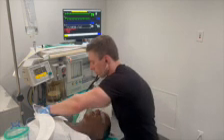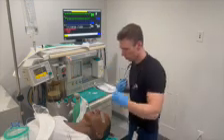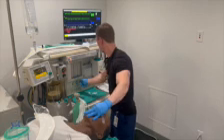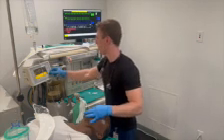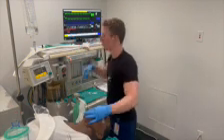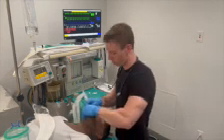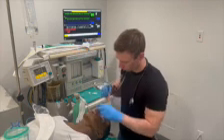With tube placement verified, we will do our left to right check and securing of the tube. While holding the tube with your left hand, use your right hand to turn on the volatile anesthetic, adjust your flow and gas mixture, adjust your ventilator settings, flip the patient onto the ventilator, and recycle the blood pressure and assess the patient's current vital signs. Once everything on the ventilator and monitor is considered and adjusted accordingly, it is time to secure the tube.